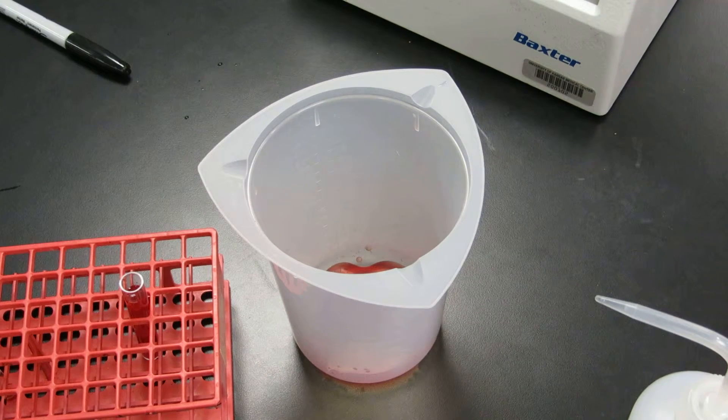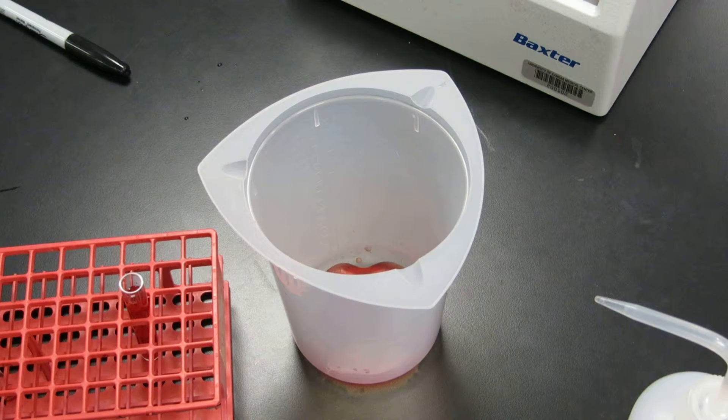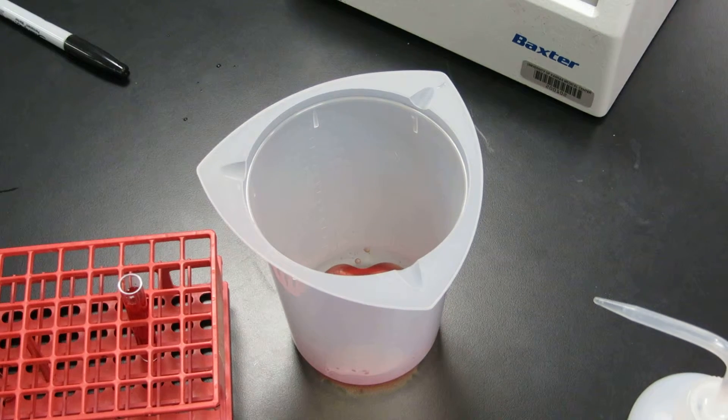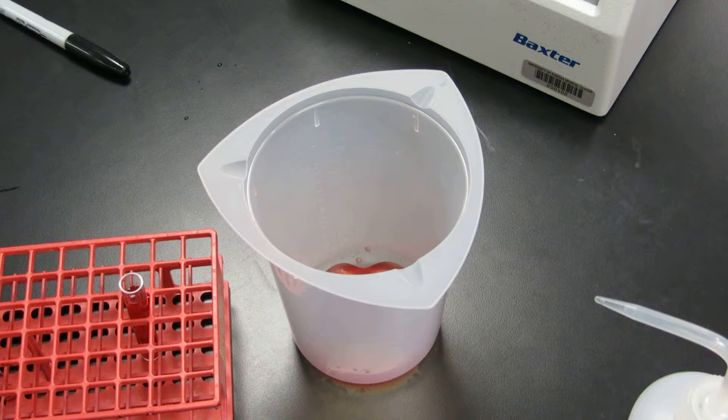You might think this is the longest 60 seconds ever, but this is actually a really good opportunity to either be reading ahead in your procedure or labeling new tubes, looking over your paperwork, deciding what the next step is. I won't make you wait all 60 seconds for all four washes, but I wanted to give you an appreciation for how long this actually takes. So we have about 30 seconds left on the centrifuge — this is a good time to figure out your next step and to really understand what's going on in the procedure.